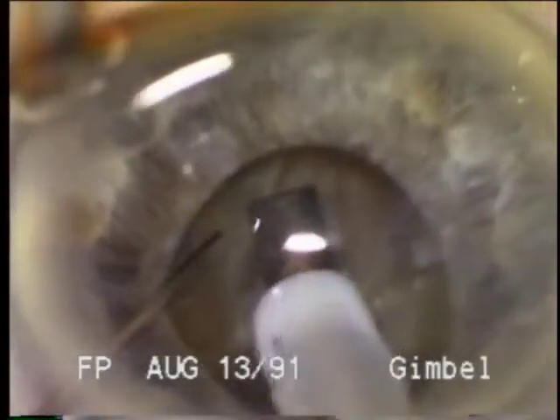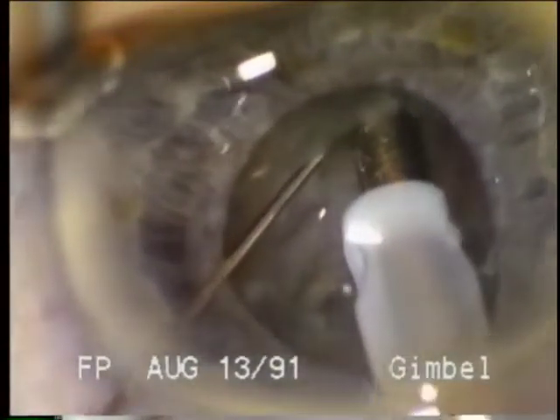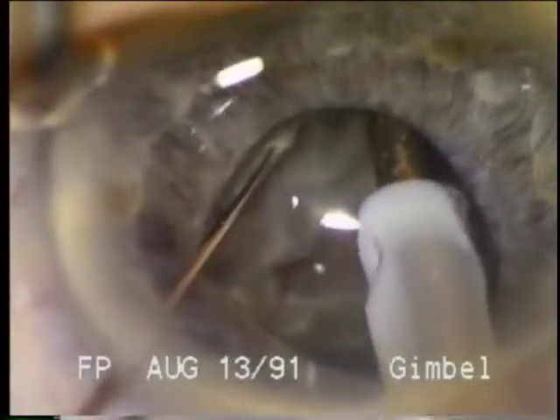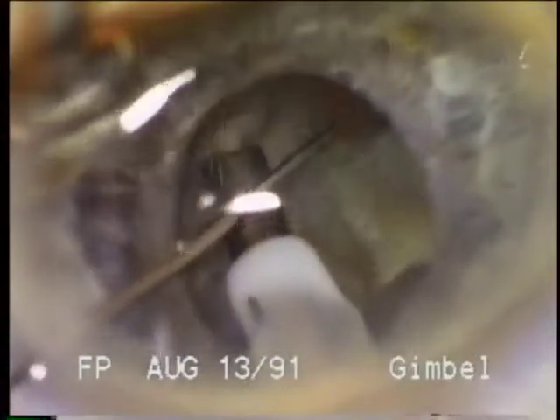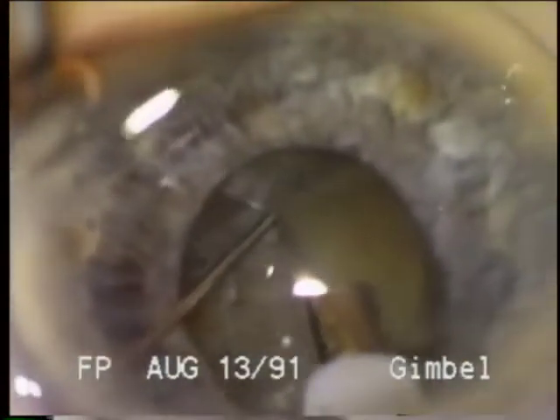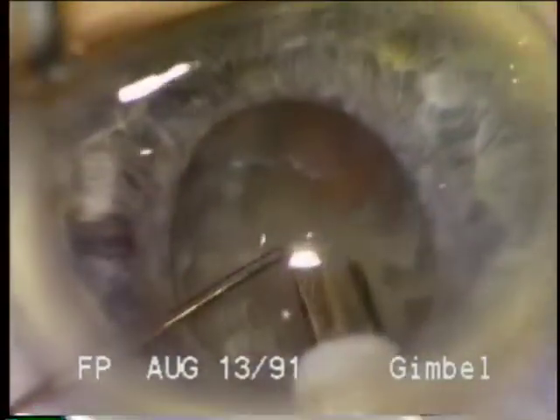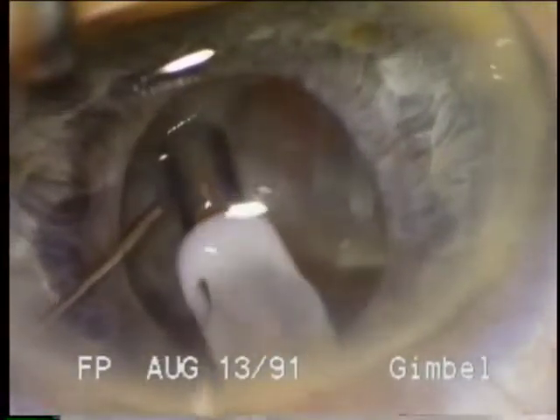Note that we're leaving the sections in place in this particular case. And there's just a short burst of ultrasound to lollipop into the nuclear rim. And then maintaining aspiration during the fracturing and not using phacoemulsification again until the material is well out into the center of the lens, as right here, well away from iris and capsule.